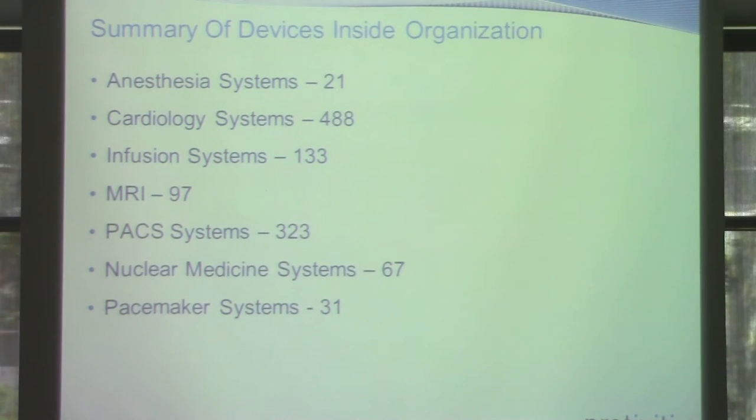When I did research on actual PACS systems, all but one vendor required you to log in through the application with unique IDs, everything like that. But they made a hard-coded web service call to the back-end storage to retrieve the images. So if you went directly at the network level to the IP, it didn't have any NTFS security permissions. It's wide open, and the hard-coded username and password were found in the user manual, and in all but one case could be used to grab all of that information.